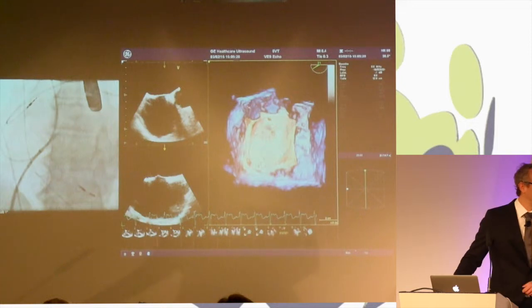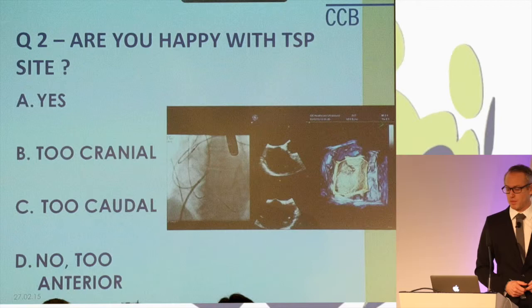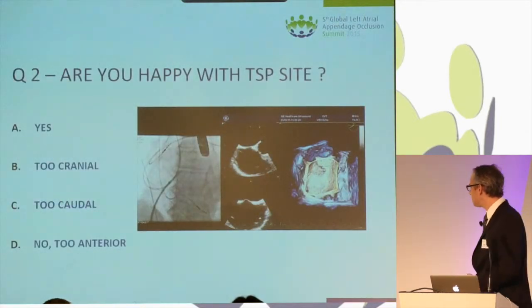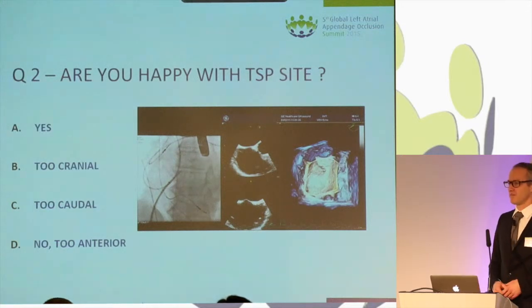So again, interaction please. Are you happy with this transseptal puncture site? Yes? No, it's too cranial? No, it's too caudal? Or no, it's too anterior?